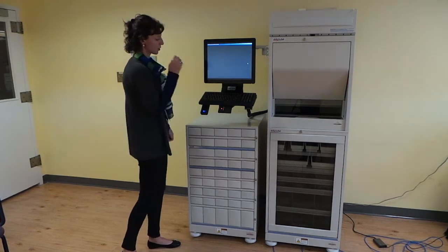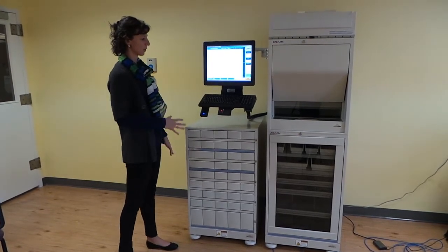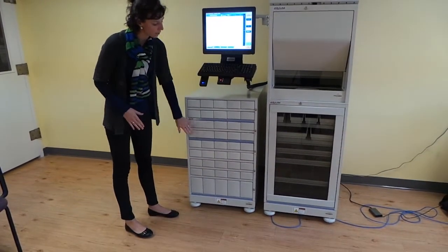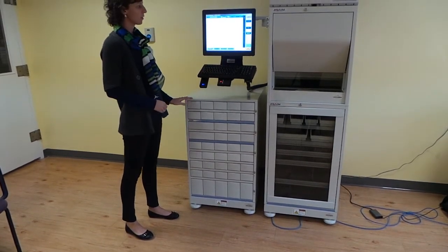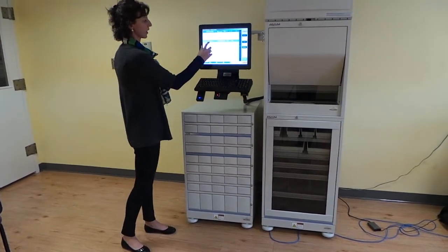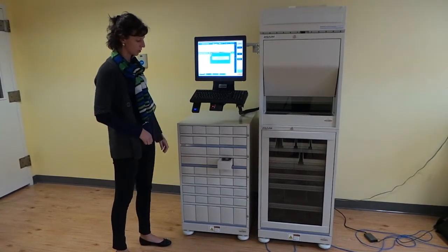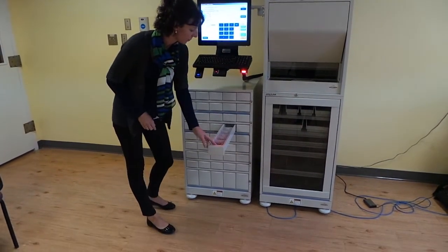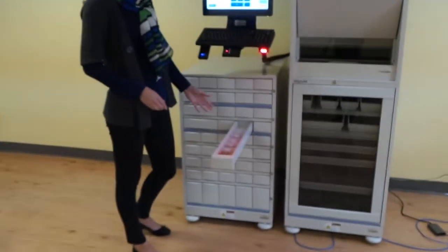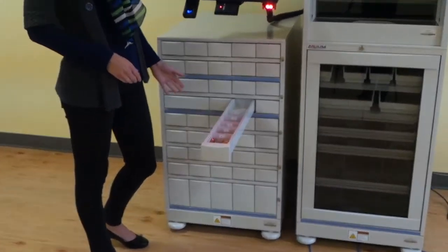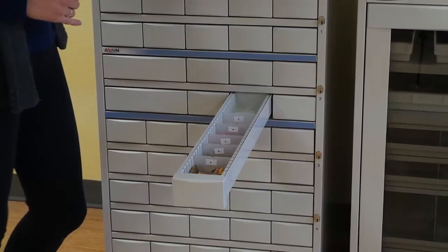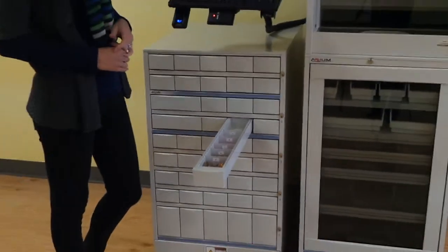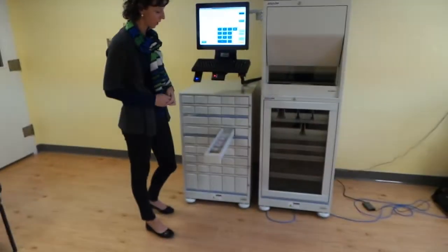Now I'm going to show you the different types of drawers within the cabinet. This entire unit here is referred to as a drawer module. Within the drawer module, there's different types of drawers. The first type of drawer is a matrix drawer. It's going to open and you will have three to six different types of medications in the drawer. The cabinet will tell you the specific letter associated with the medication that you are looking for.